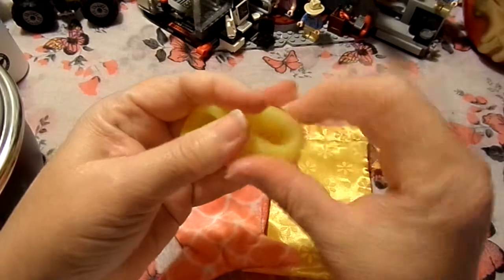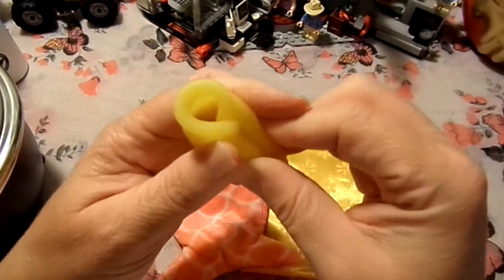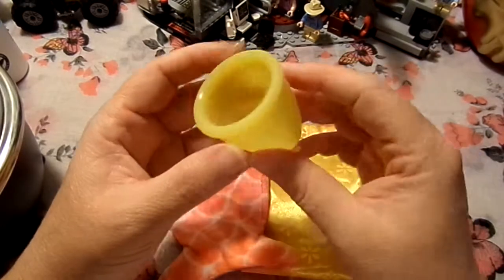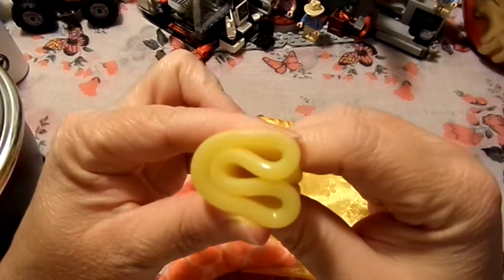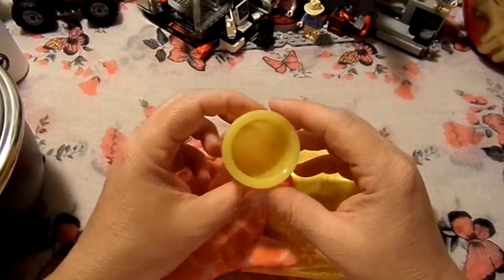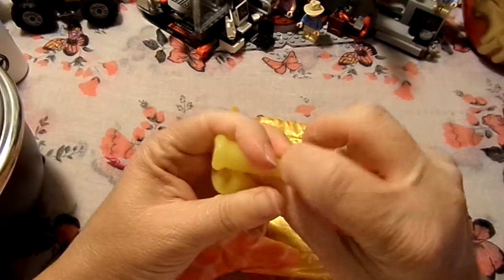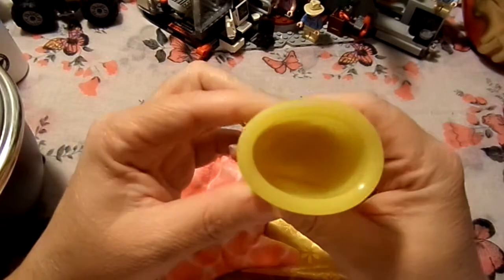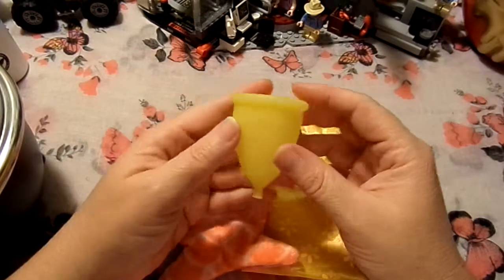However, the punch down fold just seemed to work a lot better for me, and it seemed to pop out a lot easier than the C cup fold. This C cup fold, I found did not pop out very well, obviously after putting it in. But as you can hear, when it does pop out, it is a very strong cup, and it is very rigid. Other than that, it is a very good cup.